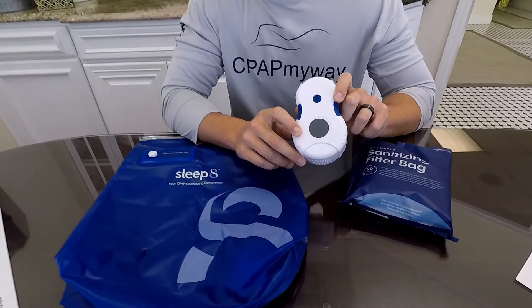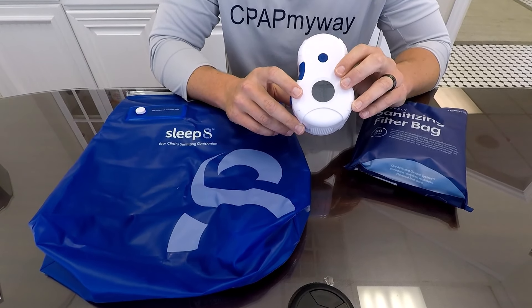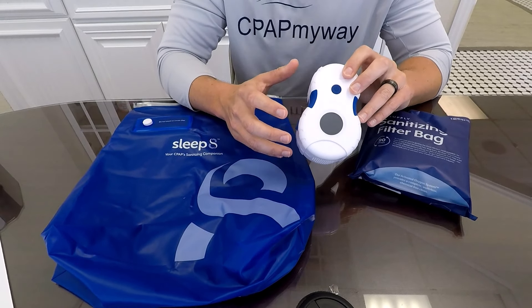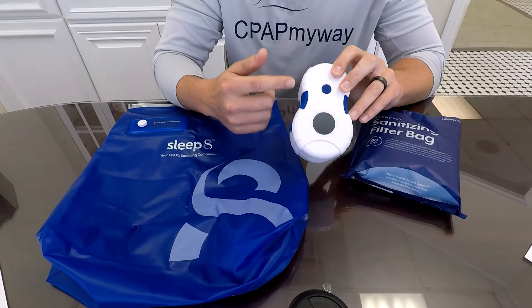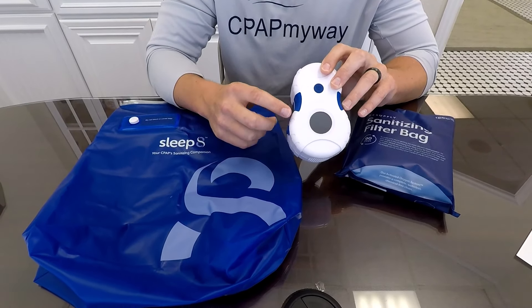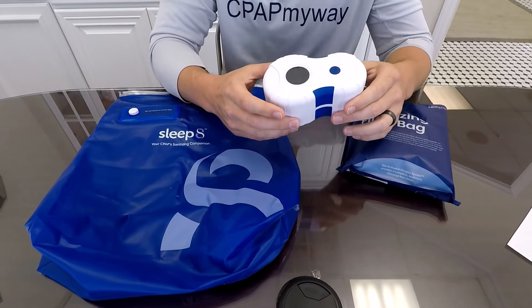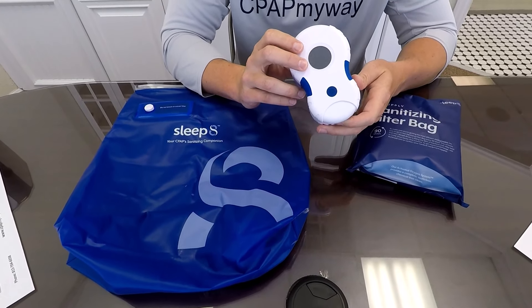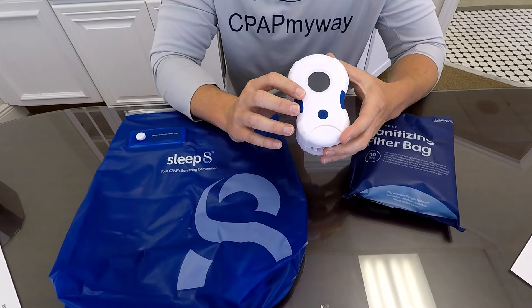First up is our current fan favorite, the Sleep 8 CPAP cleaner. The Sleep 8 is a really nice unit we've come to like a lot. It is portable and battery-powered, which is nice. It's really small — 3.3 inches across, 5.25 inches tall, and 2.1 inches thick — so it really is a palm-of-the-hand style device. It has a built-in lithium-ion battery, and with that battery installed it's still only about a 10-ounce unit.